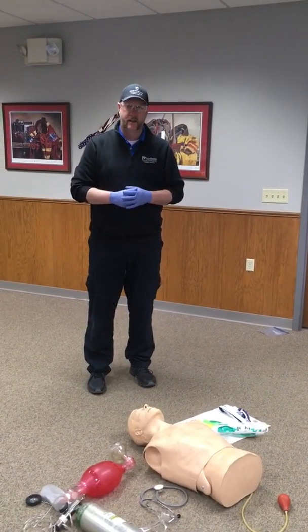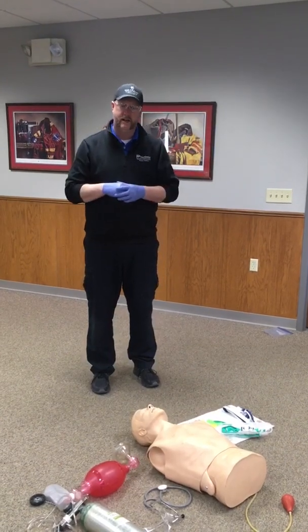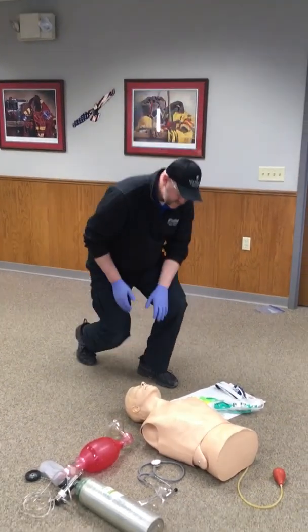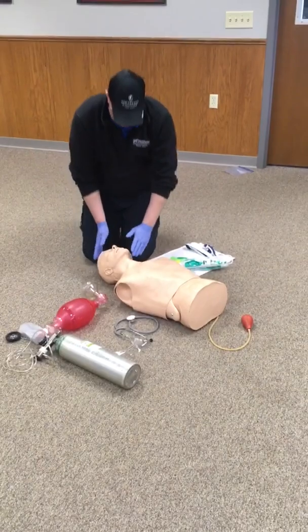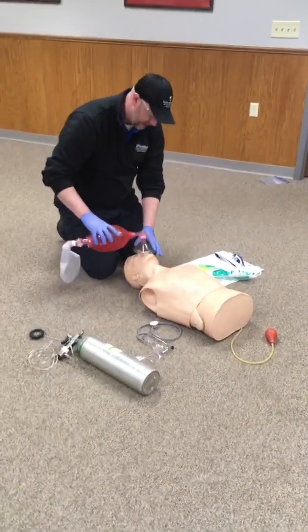When we get ready to start the station, we're going to begin. We're going to have our scene safety — look around, have our BSI on — and we're going to approach the patient. When we approach the patient, we're going to go ahead and open up the airway and grab our bag valve mask and give a breath.